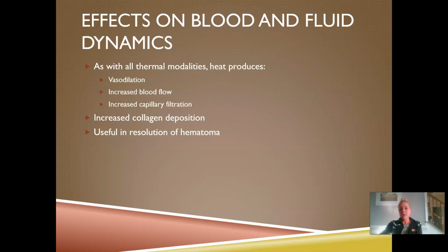The effects on blood and fluid dynamics, again, as with all thermal modalities, heat's going to produce vasodilation, increase in blood flow, increase in capillary filtration. It can also help with increasing collagen deposition, which again, speeds along that proliferation stage to speed along healing.